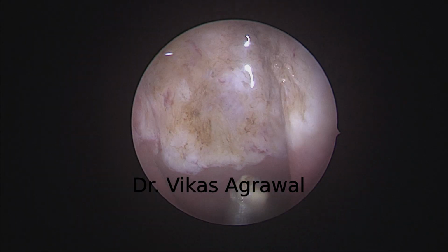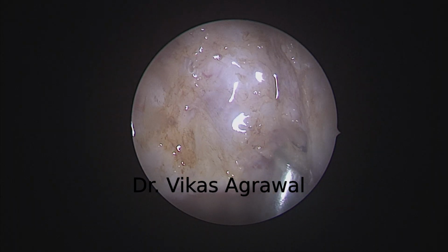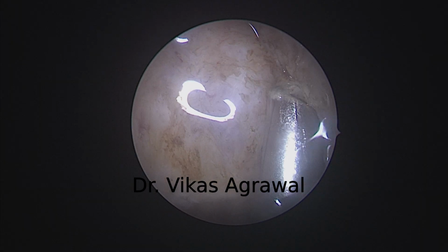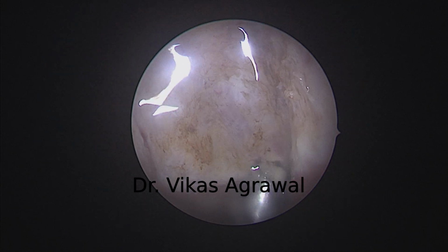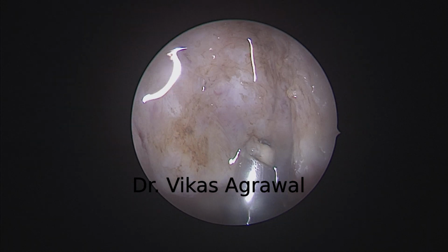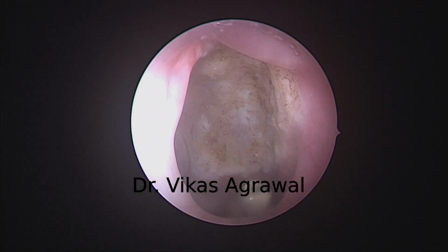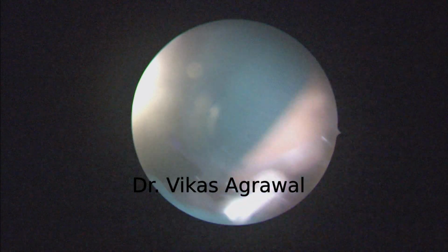Alright, so that's the end of our surgery. And suppose if there is any little bit of lymphoid tissue in the corner, you can coagulate it. Do not ablate the corners because you can have a vessel which might bleed. Now the surgery on the left side is over. Now I'll go from the right side.